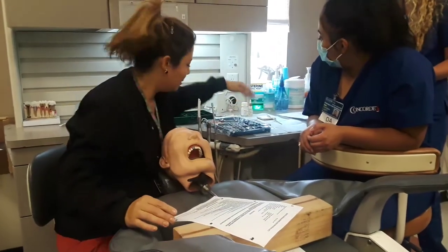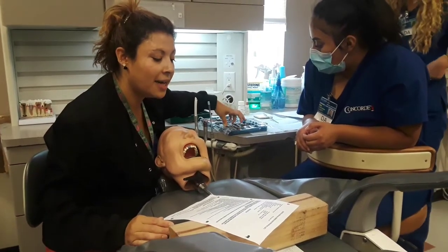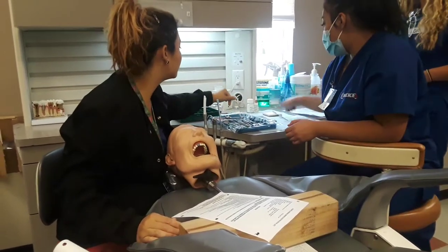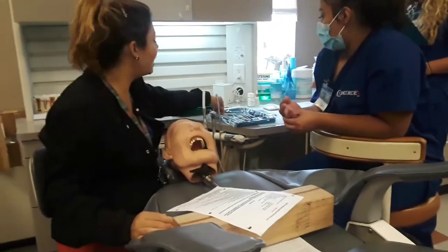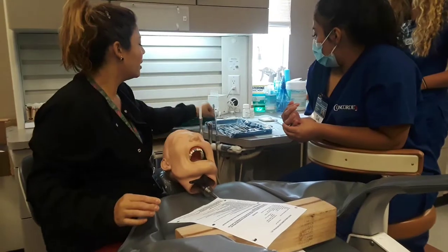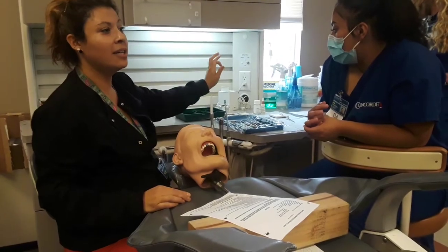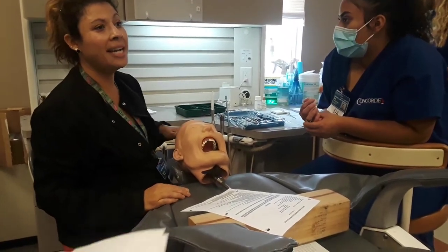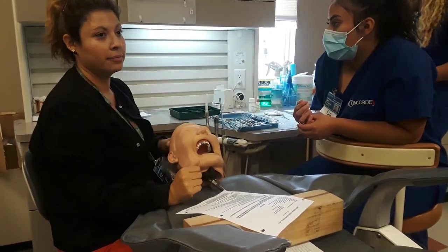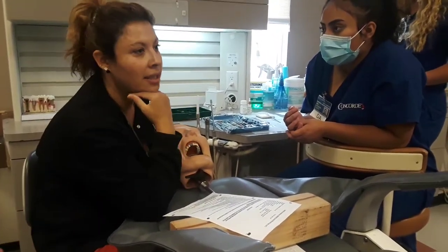Here we go — permanent cement. We've got our mirror explorer, cotton pliers, a spoon excavator to remove the temporary cement, and a mixing spatula. Anesthetic setup is ready to go if we need it. In your office, always set this up and leave it ready. What stinks about a doctor waiting is if you need to top off and it's already ready. So always set up your syringe — if you don't use it, fine.